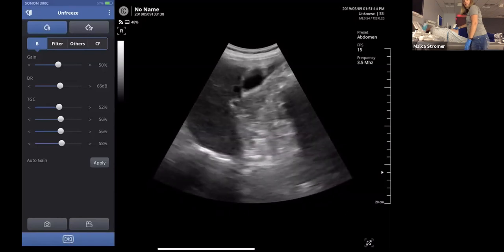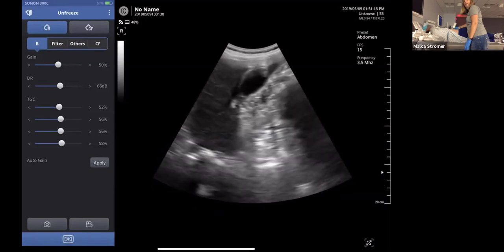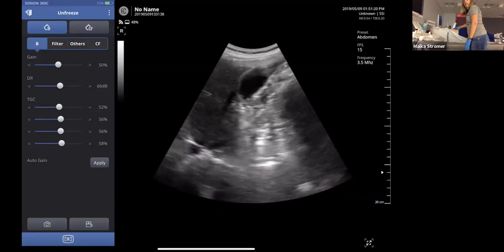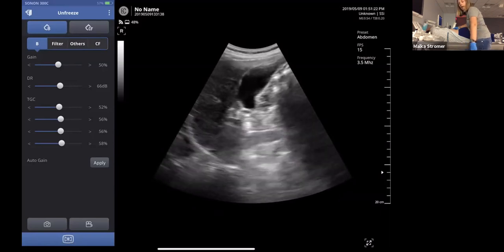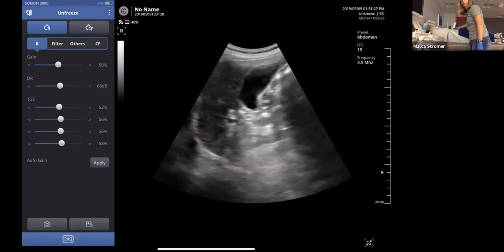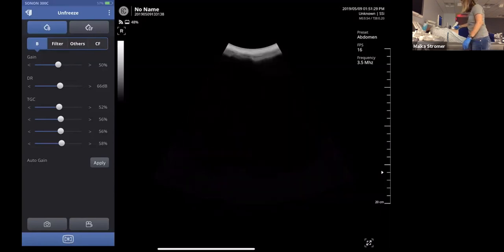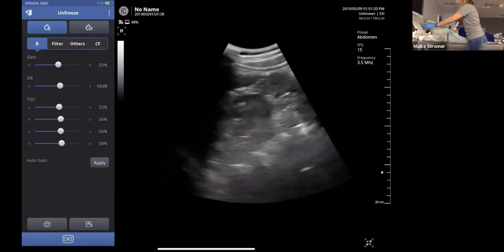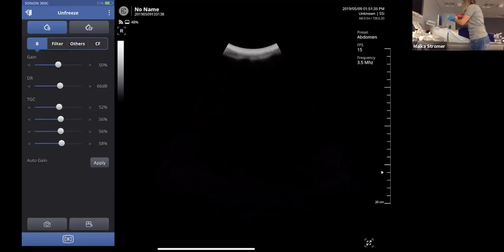But we can see, and we're going to scan to the liver surface, back to the center, and then to the bowel surface. And see a nice, clear anechoic lumen and a bright wall. Perfect. Good. Relax. Okay, since they're already up on their side, we're going to leave that there. I'm going to add a little bit more gel, and we're going to look at the right kidney.